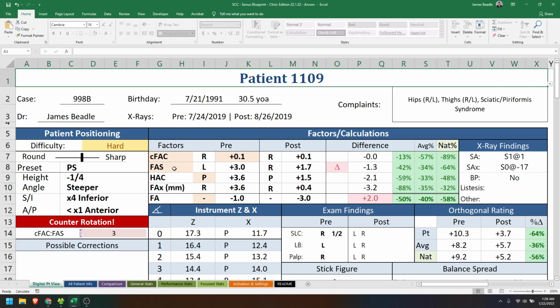Again, it slows you down a little bit so you can pay attention and actually focus on the patient, so you can get a better reduction. So just be aware of that. Highlights here: slow down, really focus, use your brains, and you'll do just fine. That's it for the digital tab.